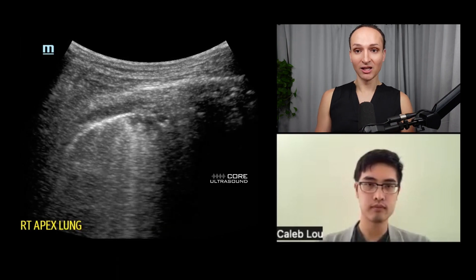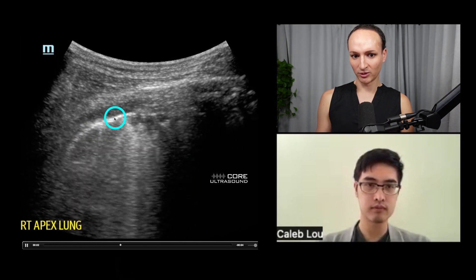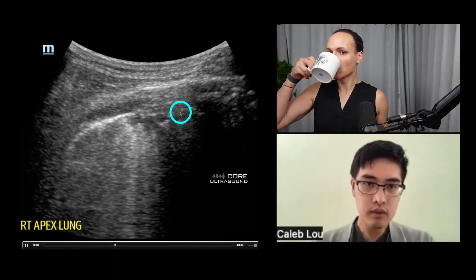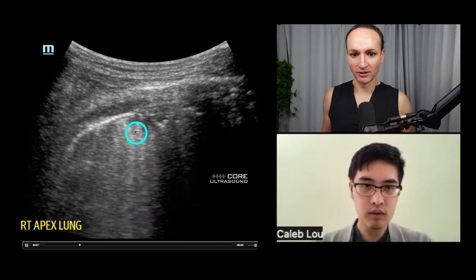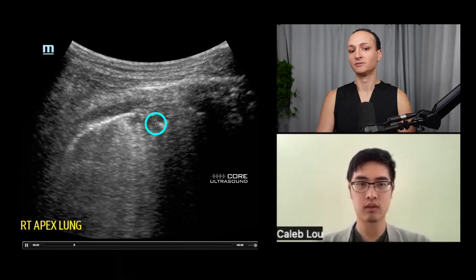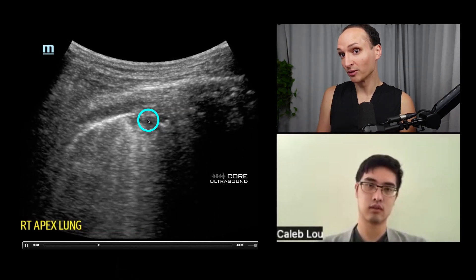This is the right apex of the lung — here's a rib with a rib shadow and the pleural line. There's a little hypoechoic thing right here. This is the pleural line, and we're seeing a break in it right here. Any idea what that could be? It's like a little dip — darker here, which means it's probably tissue or fluid.